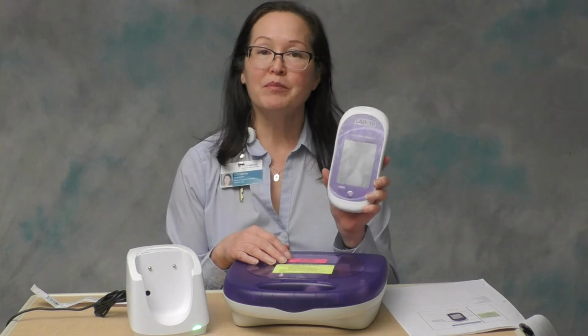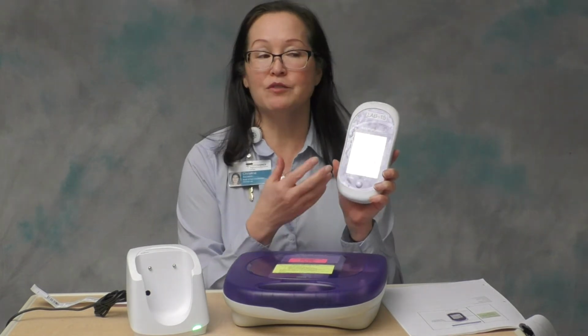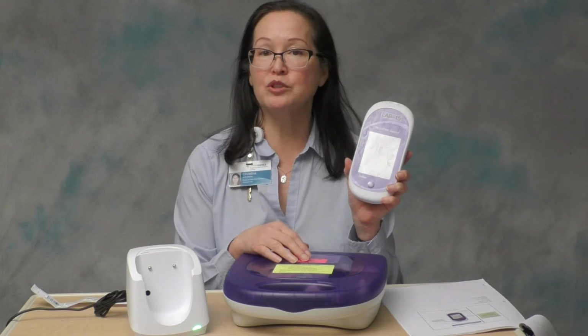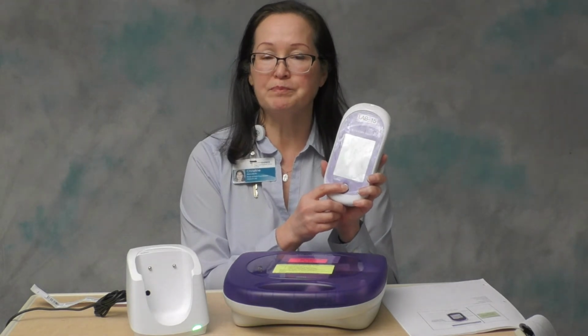So if you pick it up and it won't turn on, or the screen appears to be frozen, or it has a funny error message on it, your very first step in troubleshooting should be to press and hold that on-off button for 20 seconds to reset the meter.